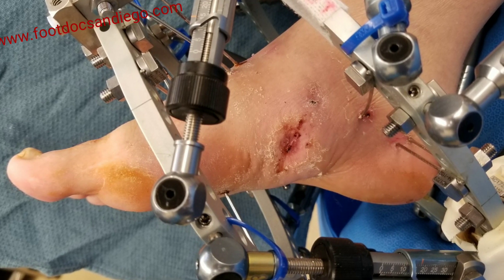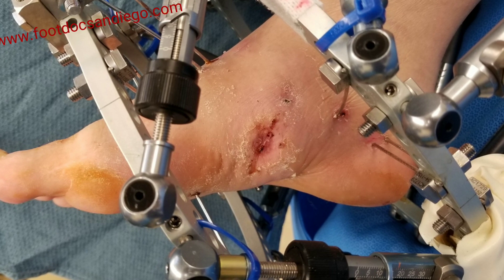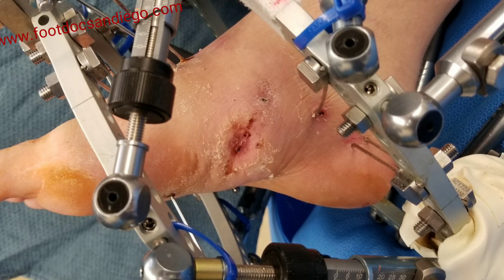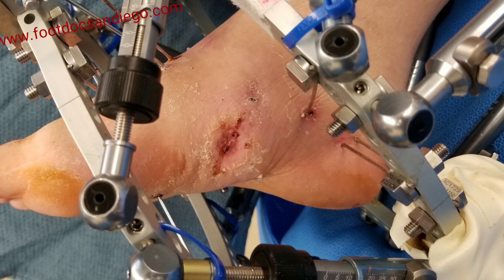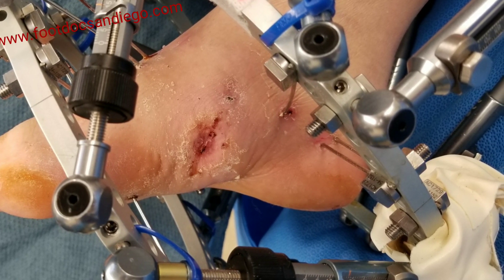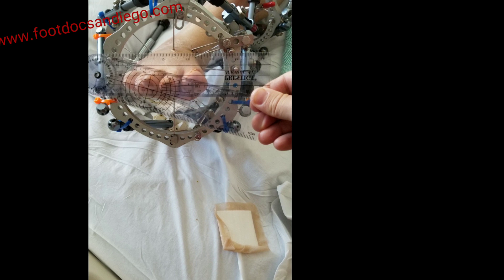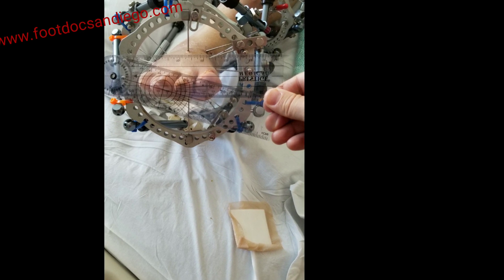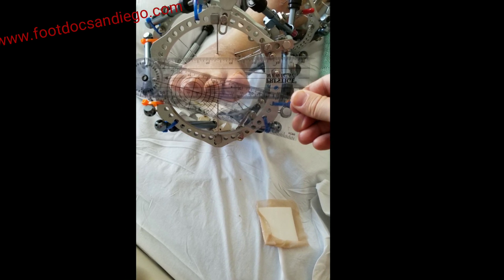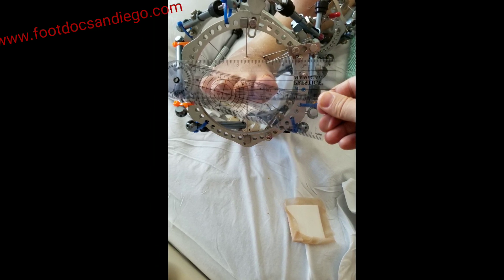Here you can see after wearing the frame for about three weeks, the wound was mostly closed up. It is vital to treat the deformity prior to deciding on wound care — all the wound care in the world is not going to do much when you have such a large dislocation subluxation. The patient received computer-assisted deformity strut turns with careful analysis of Méary's angle, AP talo-first metatarsal angle, and also making sure in the axial plane there was proper correction.